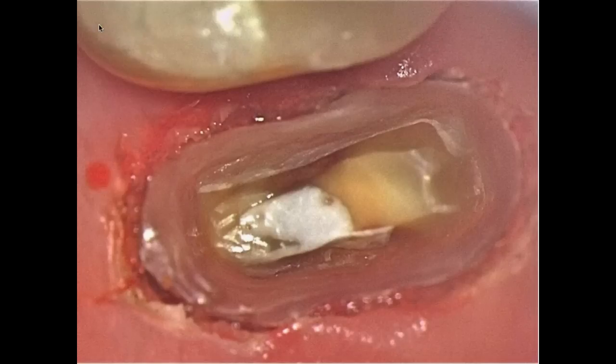There is another question about disadvantages. We have seen many advantages, so again a question, what other disadvantages do I need to pay attention to? And isn't it like wearing eyeglasses when you don't really need them? Can you compare that? Well, I'm wearing eyeglasses all the time, and that's not a problem at all because you can adjust your eyepiece to the eyeglasses you are wearing. If you have good eyeglasses, you have a neutral adjustment of your eyepiece. And I can't really see any disadvantages, except it takes a little more time in the beginning when you're using it. But after that, I think you even save time in many fields.